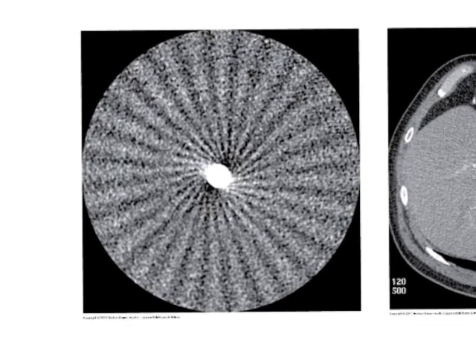This is a windmill artifact, and if you see this, you're pretty much screwed. No, I'm just kidding. It's perfectly normal. Most of the machines have presets in place to fix this, but it has to do with trying to sample quicker than you're scanning. That's all I'll leave it at. So if we're trying to do this, and really we should only be doing this, we might get that windmill artifact if we're out here.